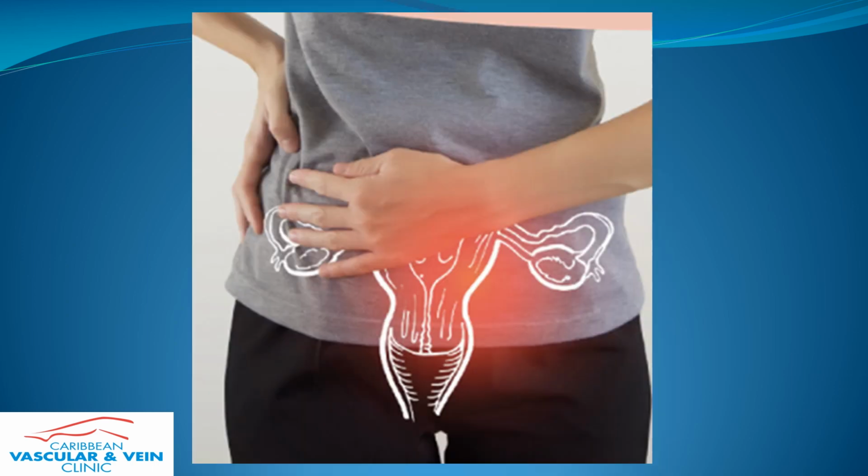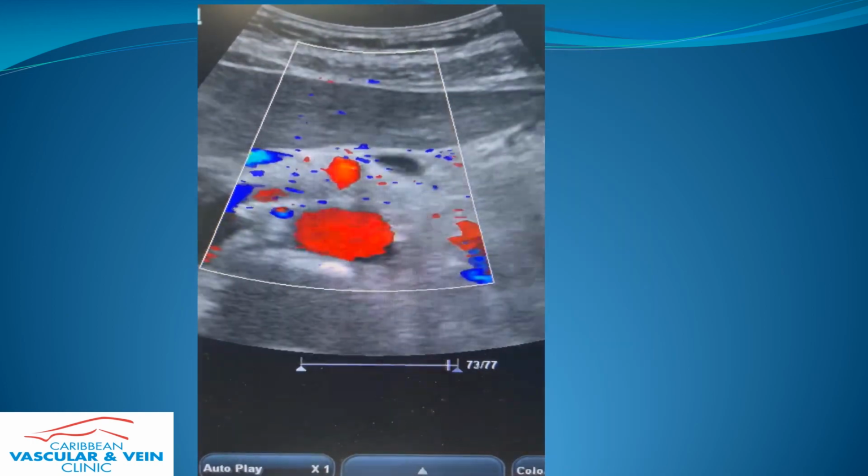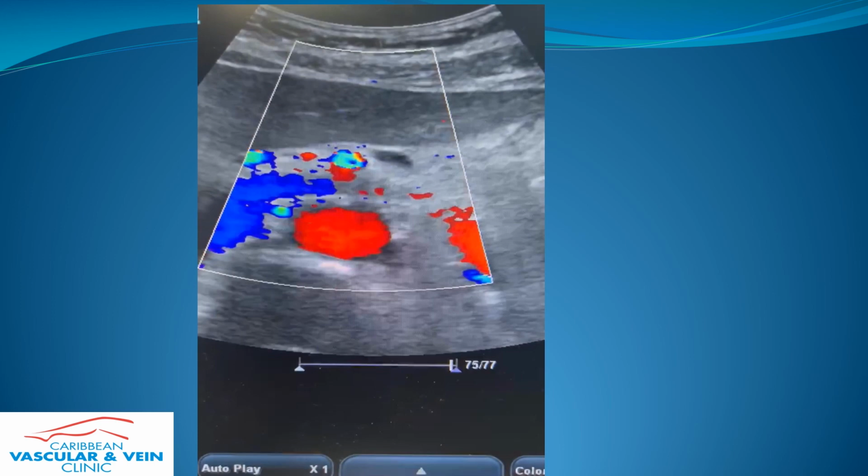The patient experienced immediate cessation of her original flank and pelvic pain, but described the onset of a vague, dull back pain which lasted for 1 week. She is currently asymptomatic. A venous duplex at 3 weeks post-procedure reveals a patent stent with flow, no reflux down the left ovarian vein, and shrunken pelvic veins.